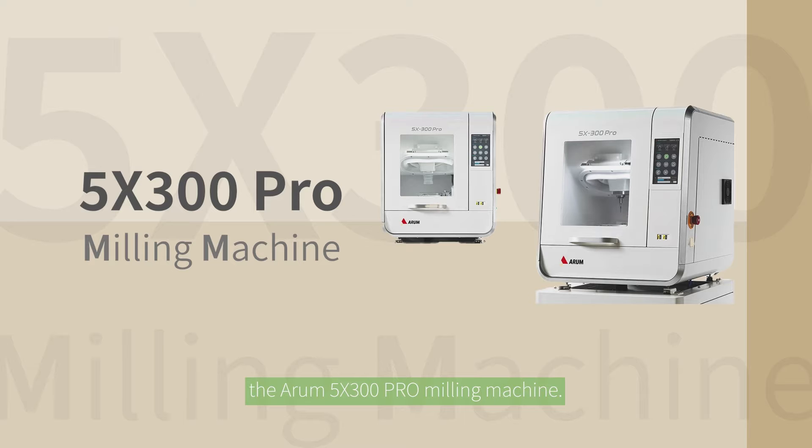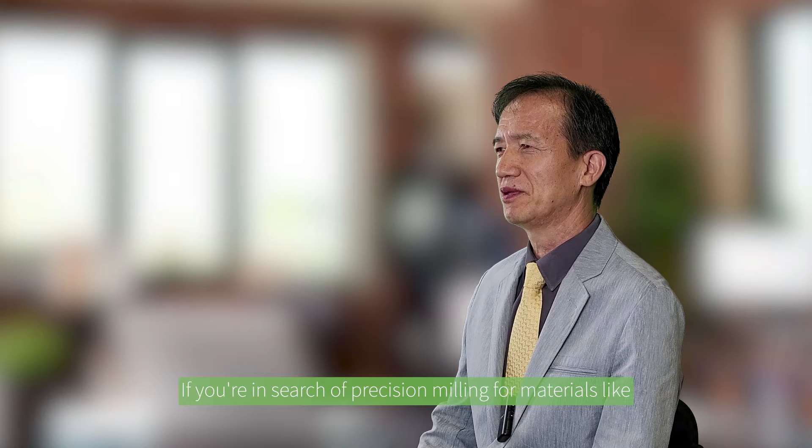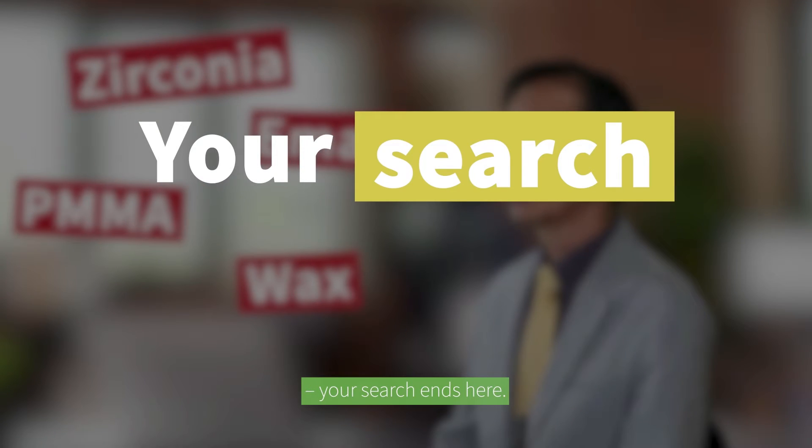The Arum 5X300 Pro Milling Machine. If you are in search of precision milling for materials like zirconia, e.max, PMMA, and wax — with metal excluded — your search ends here.